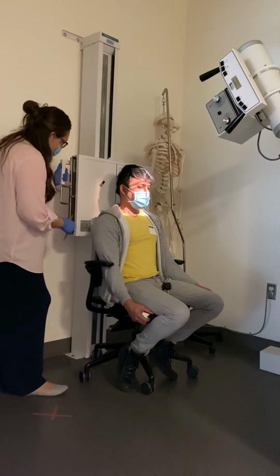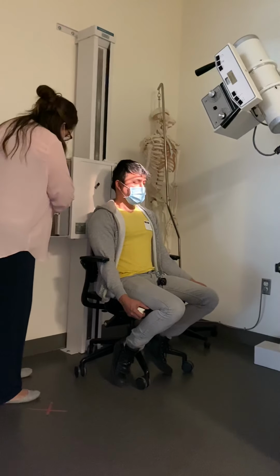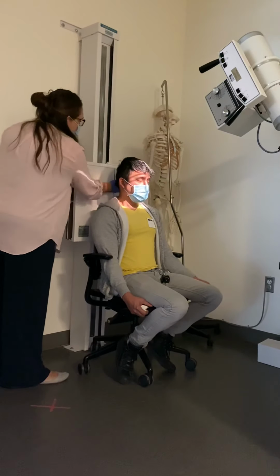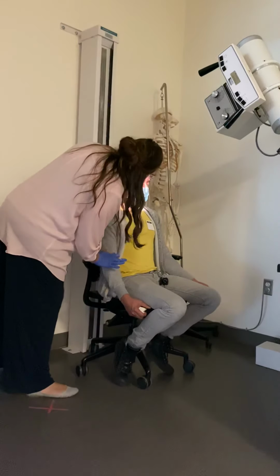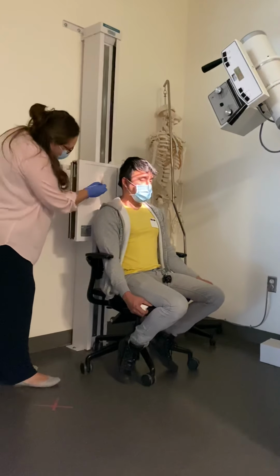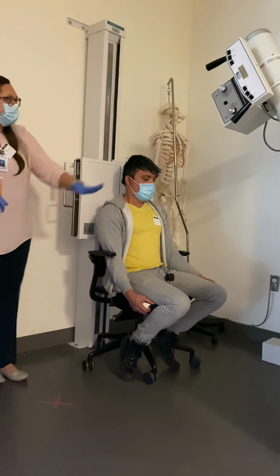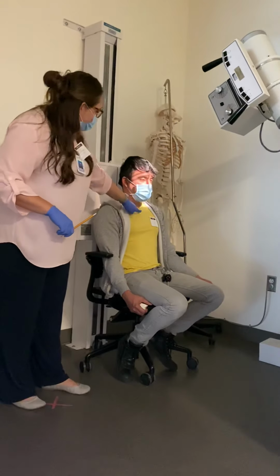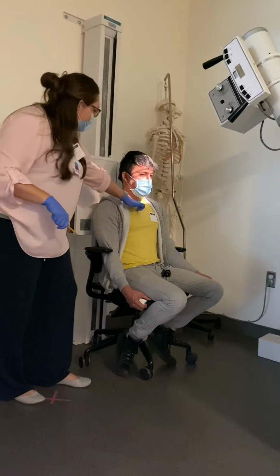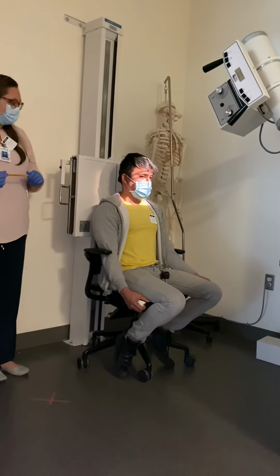This board's going to lower down behind you a little bit more. Make sure that I'm mid-sagittal plane and there's no rotation. And I'm going to check one more time. Tuck your chin down just a little bit more. Making sure that OML is perpendicular. Again, you're centering at the glabella, but you always want to double check. Since I had him tuck his chin down a little bit more, I had to adjust it. But always check to see if you can see the shadow of the mandible with the light below it so you're not clipping it. Okay?